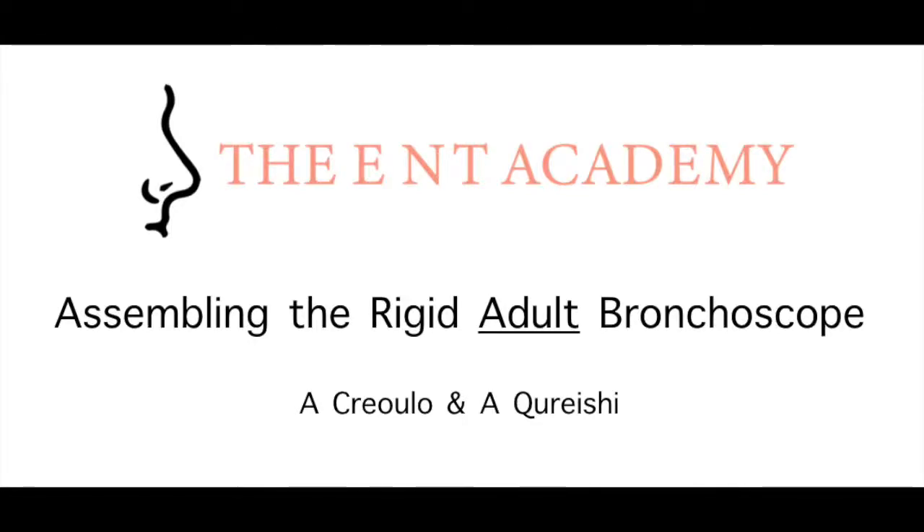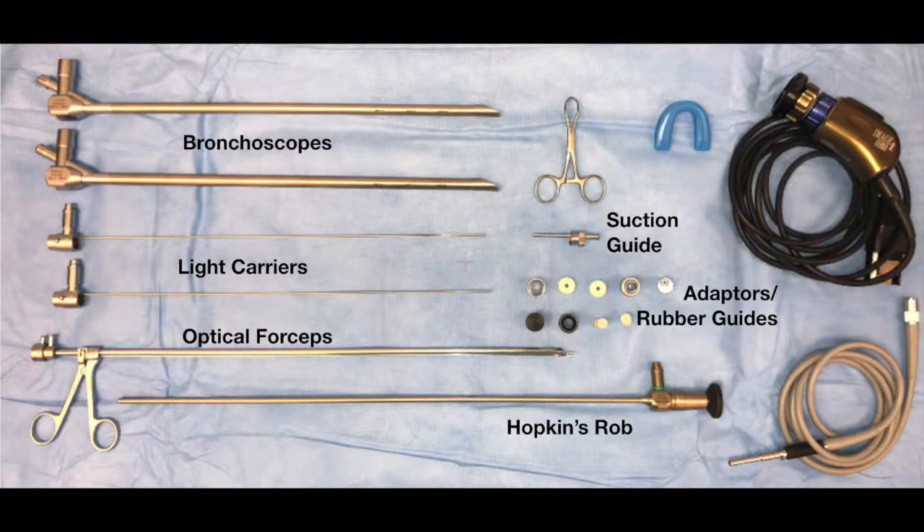Welcome to our instructional video on assembling the Rigid Adult Bronchoscope. Our kit usually contains two different sized adult bronchoscopes, light carriers, optical forceps, a Hopkins rod, suction guide, adapters with rubber guides and camera and lighting equipment.